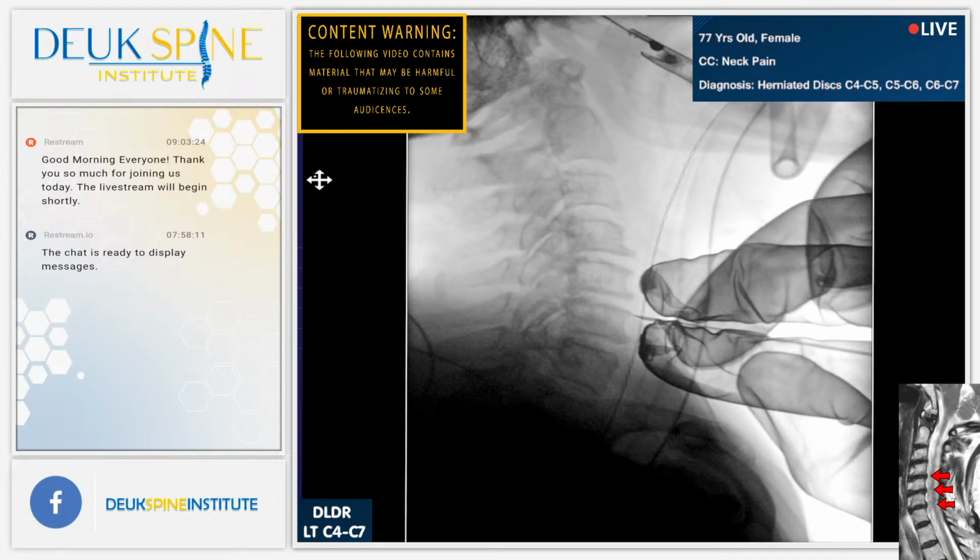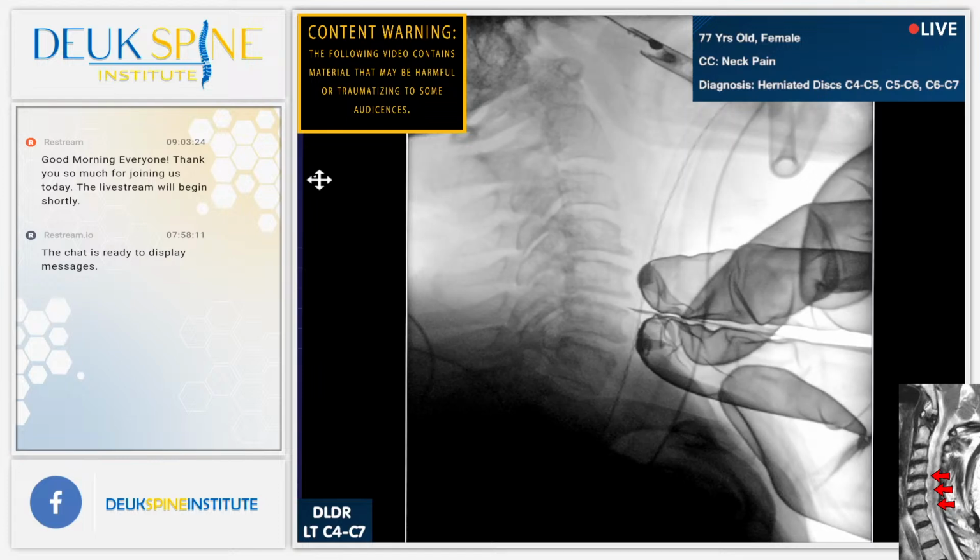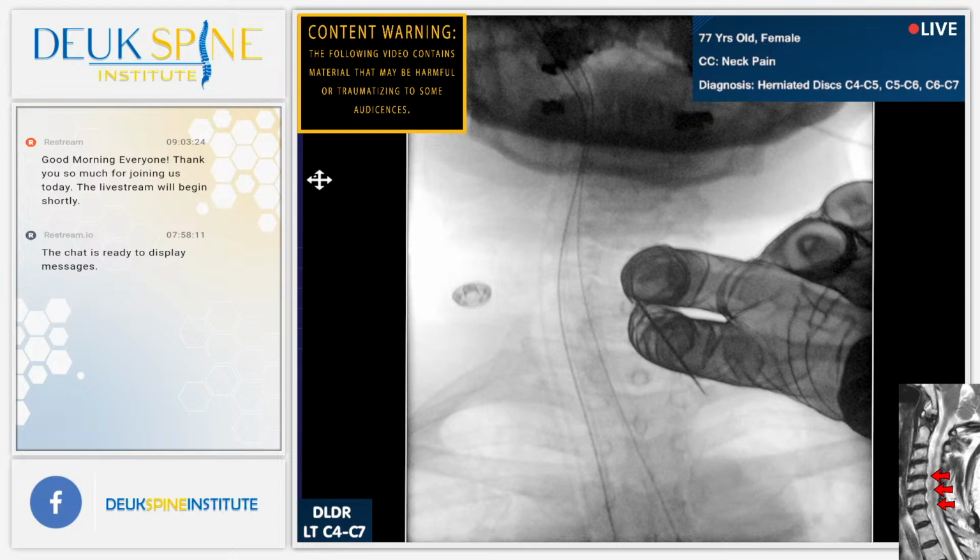Now I'm touching the spine, okay? You can see the tip of my needle touching the front of C6. I'm going to lift, slide north just a little bit, retouch, and we're in the front of the disc right there. It's perfect. I'm touching the ALL, anterior longitudinal ligament, AP. Let's see, make sure we're in the middle of the spine quickly. Shot. We are. Back to a lateral. So the needle tip is right in the center of the spine where you want to be.